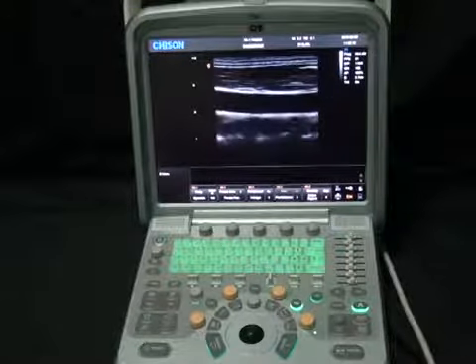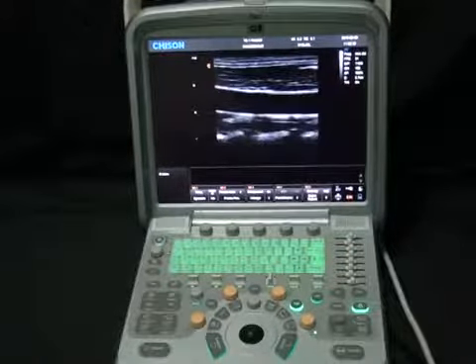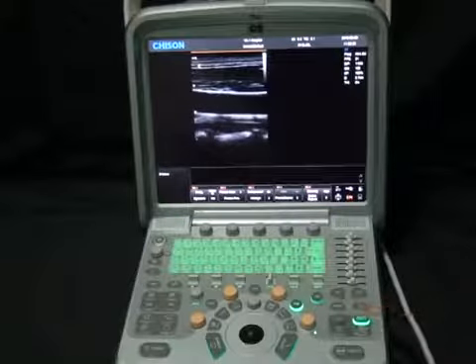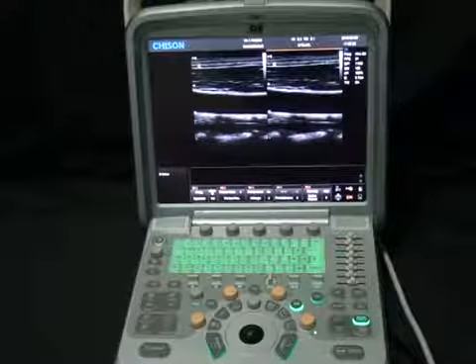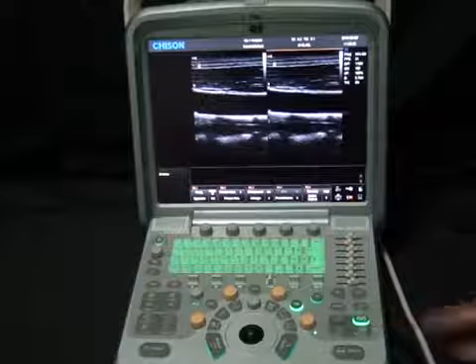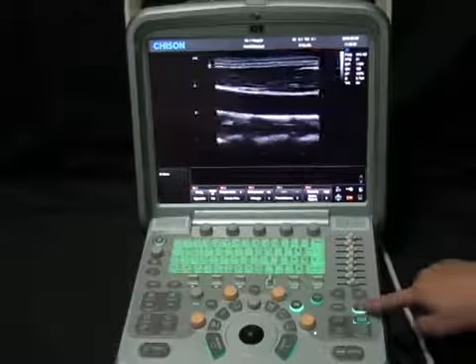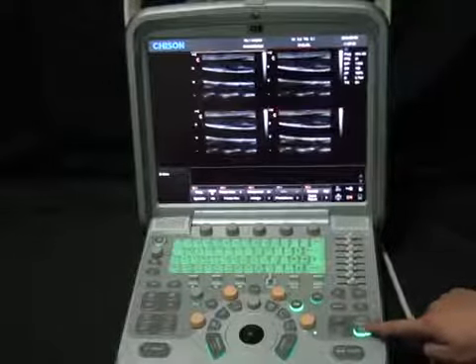What is worth mentioning is that we have 2B mode and 4B mode. For example, 2B mode. With dual screen, click for the first and get one active. Push it again and the next becomes active. Back and forth allows you to switch between those. Push on the single key to go back to the single B mode. The same works for the quad screen.